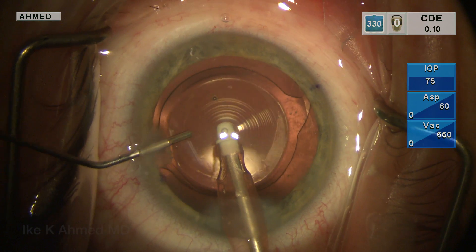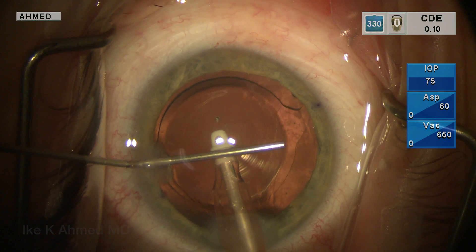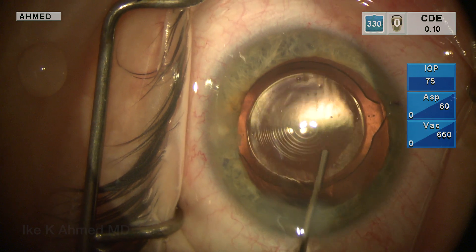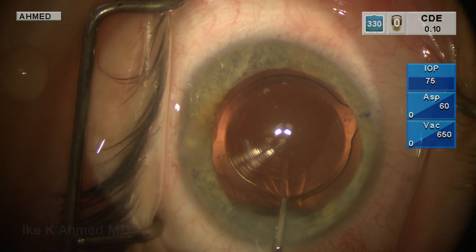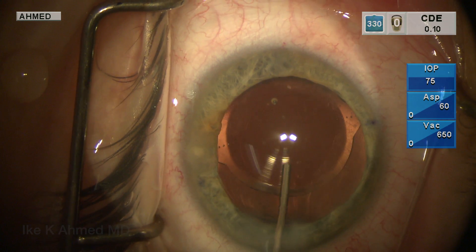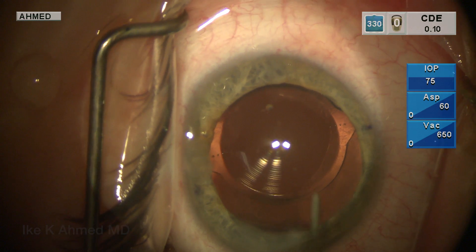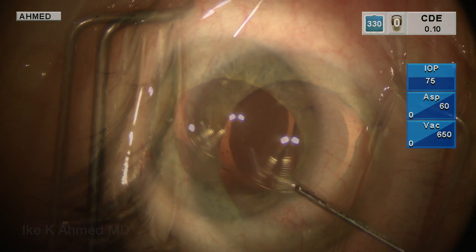At this point, we're going to ensure the IOL is centered well after we re-inject some miochol and also some viscoelastic to stabilize the anterior chamber for the pupil repair component of the procedure. We'll position the lens here using the first Purkinje image, as we see here, to center it over the bullseye of the multifocal lens, and of course, in this eye, we have it placed slightly nasal to sit in position with the patient's visual axis.